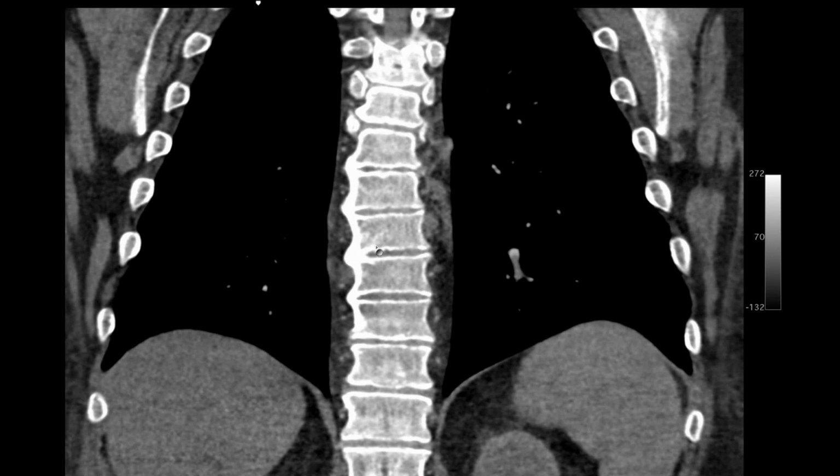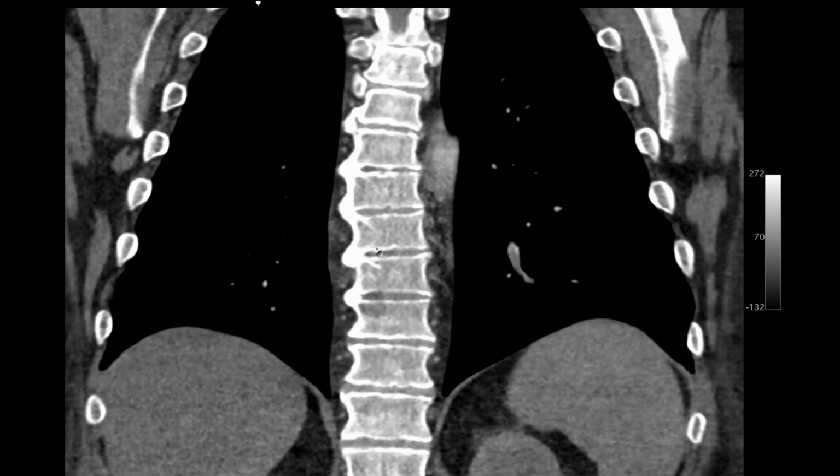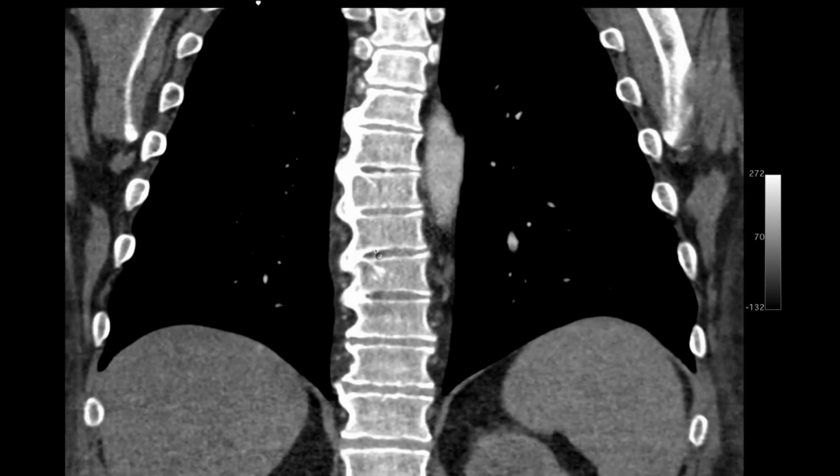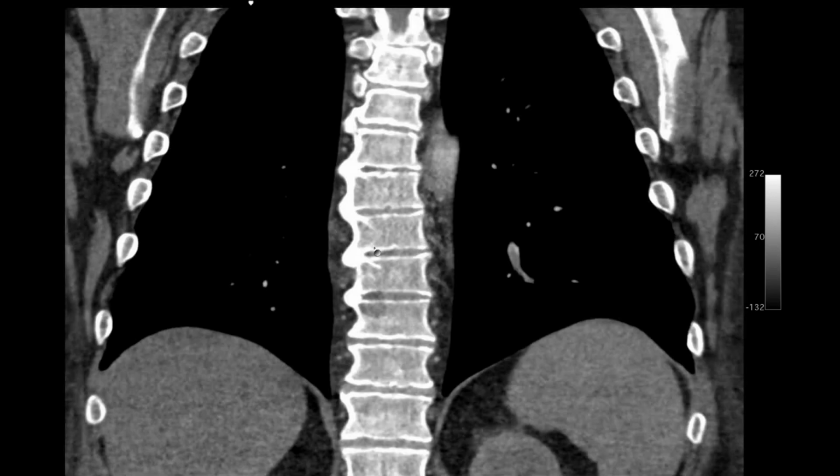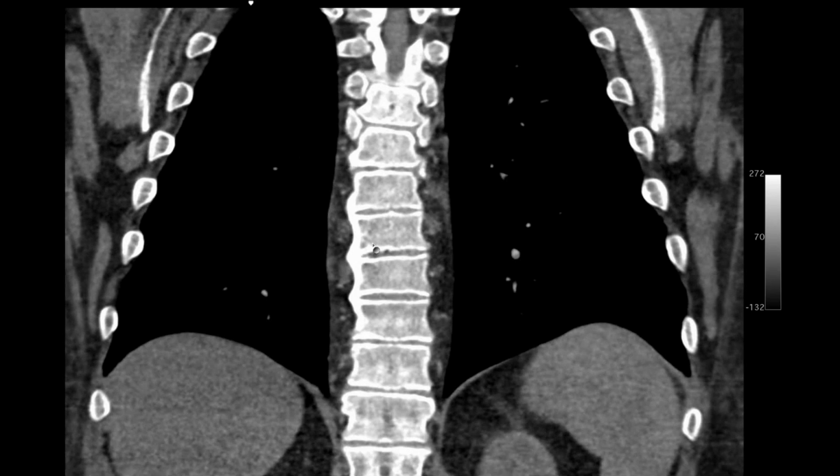Where does the 200 threshold come from? Because I've heard 150, which I still think is higher than it needs to be. I can't find any actual data on it. No, it's all complete garbage. Complete garbage. I'm sorry, it drives me crazy. People put ROIs. Yeah, exactly. Well, we're all in agreement. I come in and I see a study where it's on the PE, and I'm like, what? If you can see it, you can see it. If you can't, you can't.